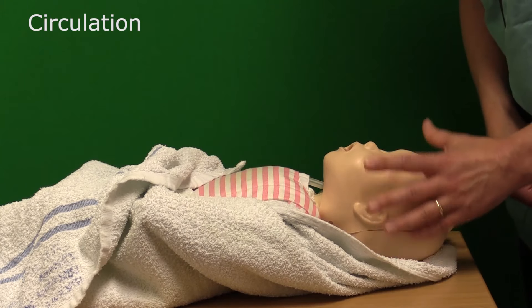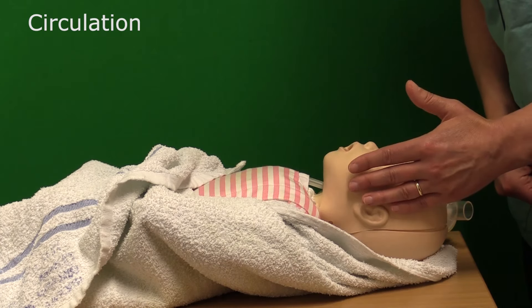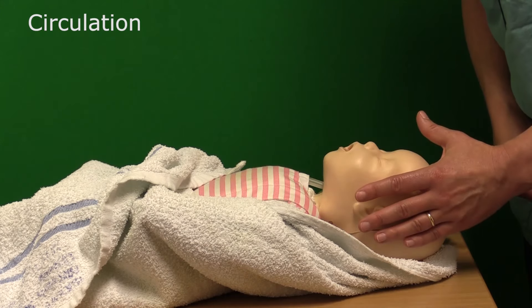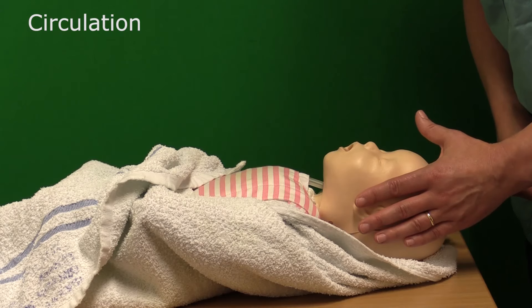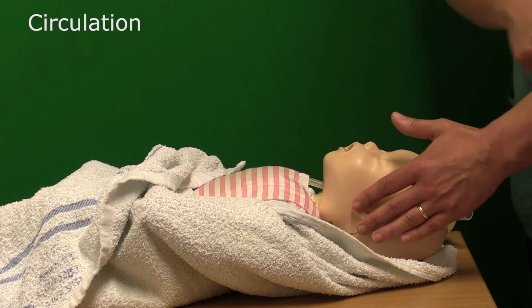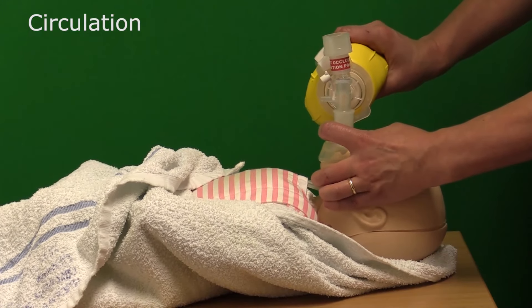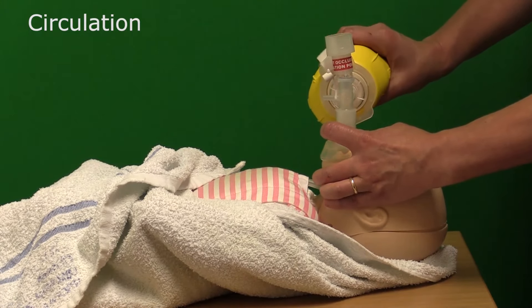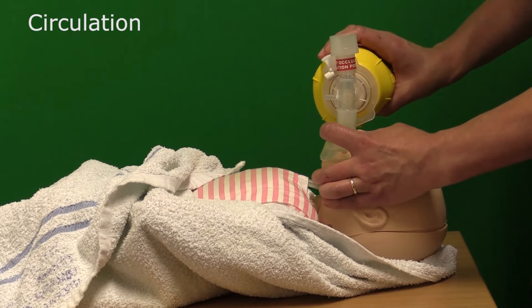If you've successfully achieved airway and breathing — opened up the airway successfully enough to make the chest rise and fall during inflation breaths — you are then able to give a further 30 seconds of ventilation support if the heart rate is still slow. These ventilation breaths are much shorter, lasting just one to two seconds each: one second on, one second off. That is done for a further 30 seconds before you reassess the baby again.